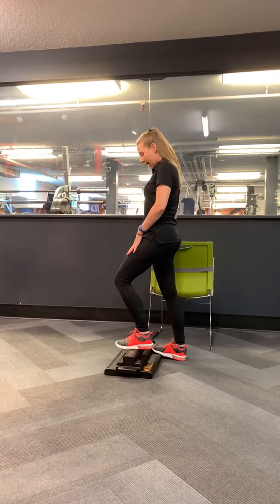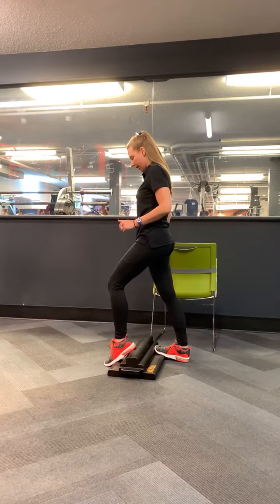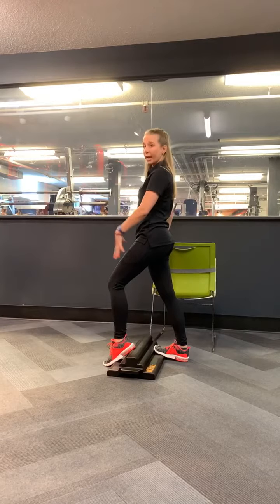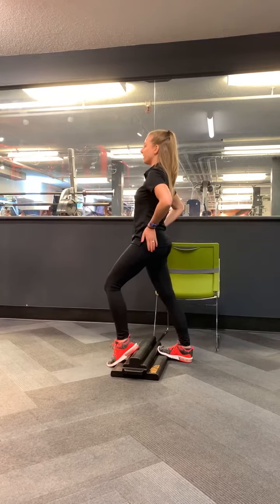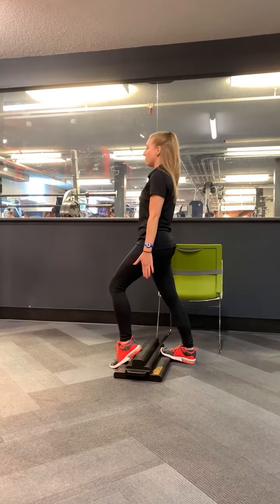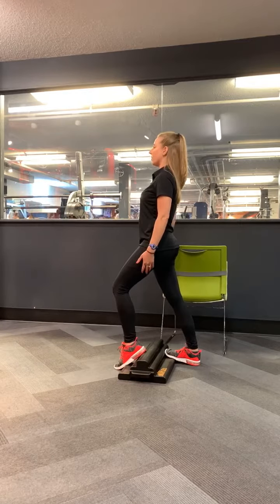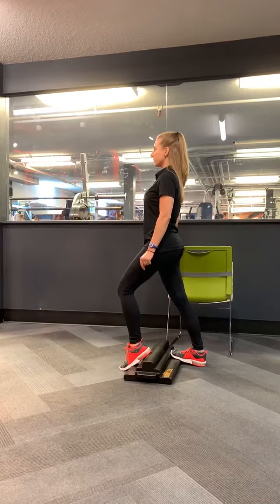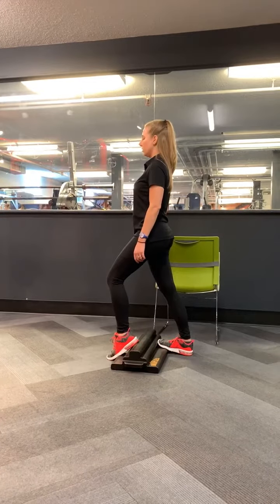So you're going to take that left foot, you're actually going to slide your toes all the way to the ground in front of the Moflex. So now we want to really make sure that we've got equal distribution between our back foot and our front foot. And once you have your feet in position, again, bringing those hips forward so you can actually bend that front knee so you can shift forward over top of the Moflex. Bring those shoulders back, stand nice and tall. Again, we're going to hold this for 15 seconds. We're going to go 3, 2, 1.